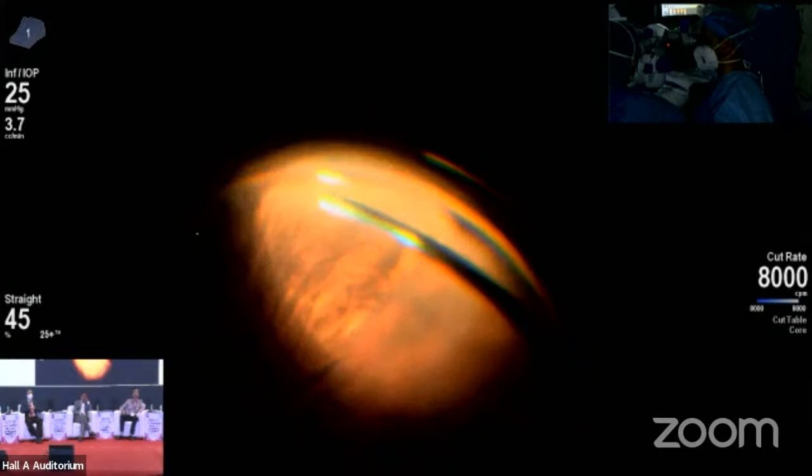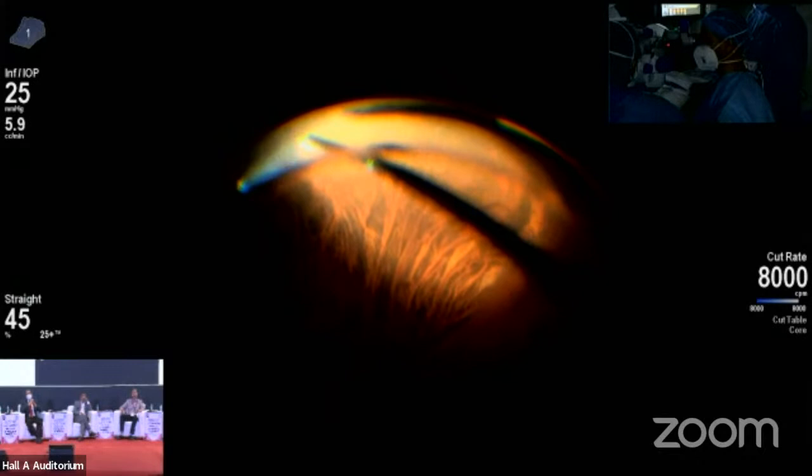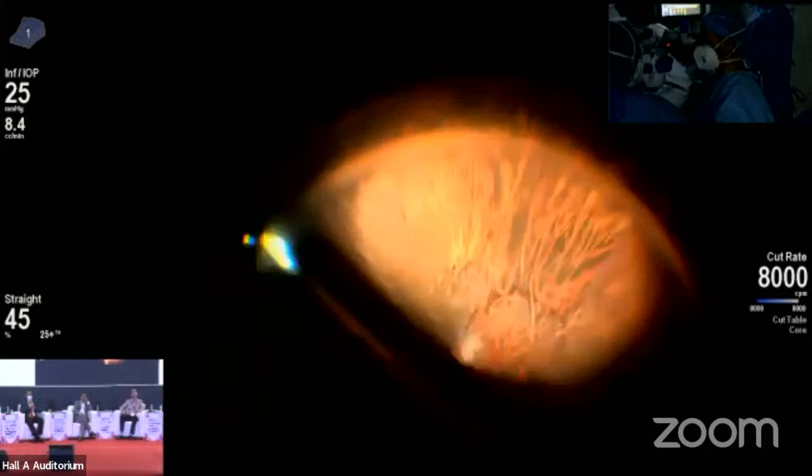So at times, once you implant the IOL, the visualization may be a little bit challenging, but with wide field systems, usually we don't face any issues. As you can see, now I am seeing through the aphakic area of the pupil, and we are removing the peripheral vitreous as much as is possible.